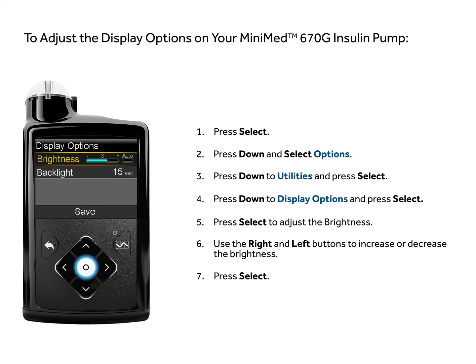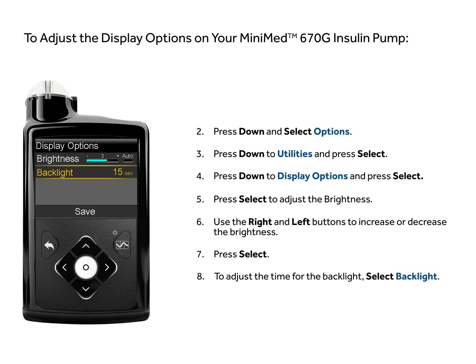Press select. To adjust the time for the backlight, select backlight.